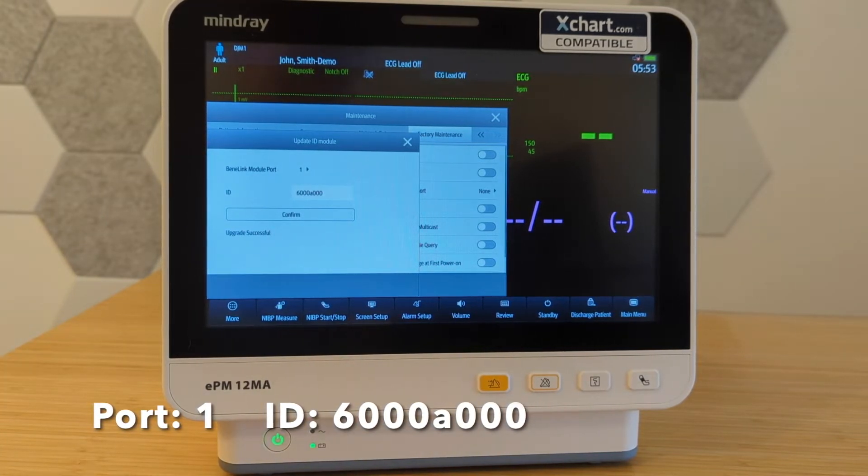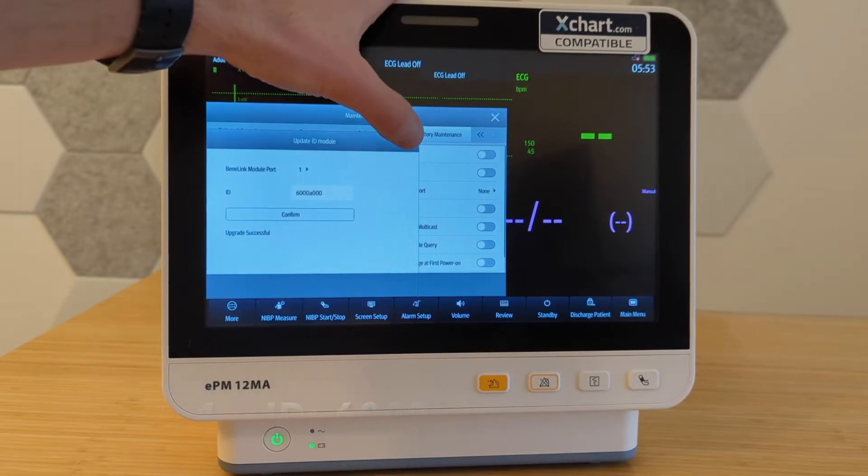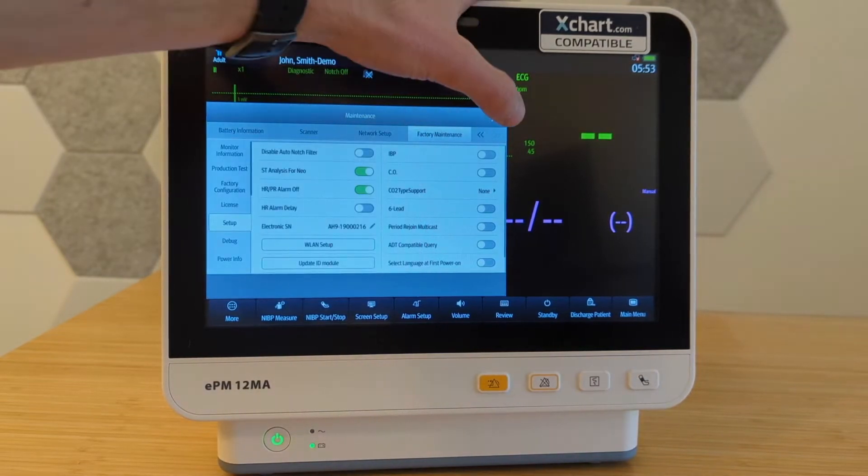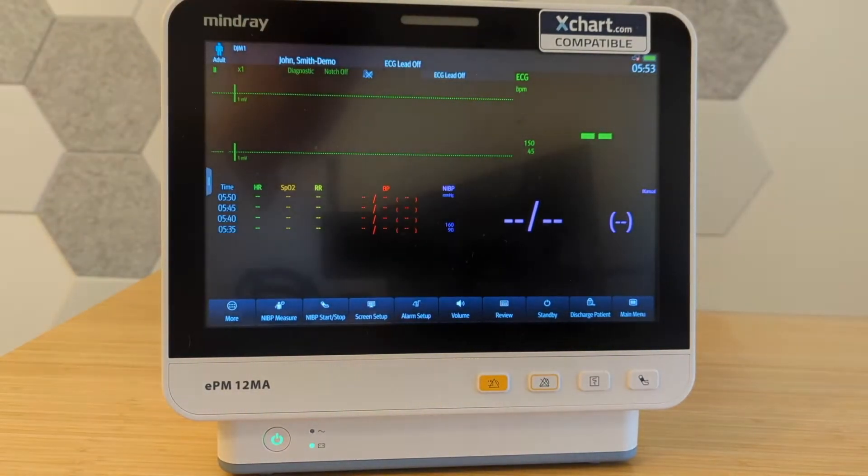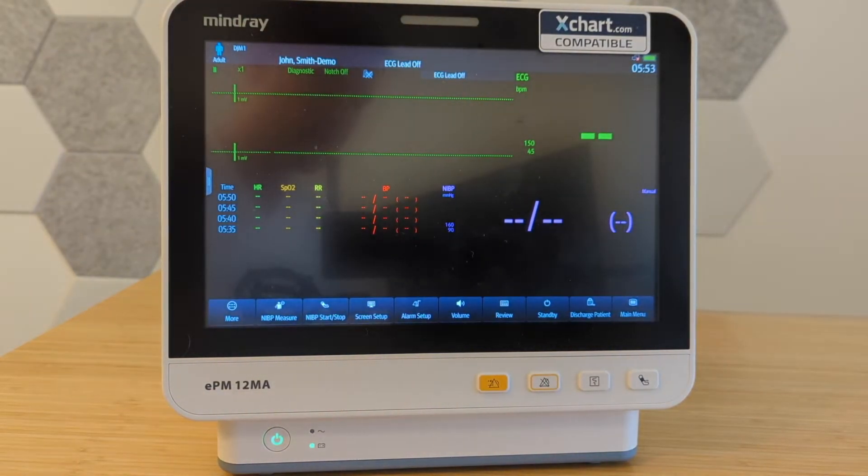And at this point, those are the settings we need. That really should be it. And the next thing we need to do is just hook up the cable.